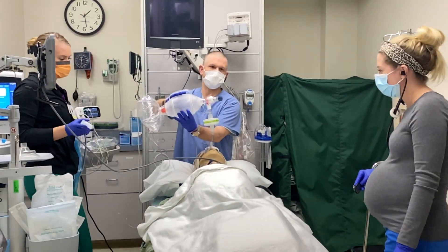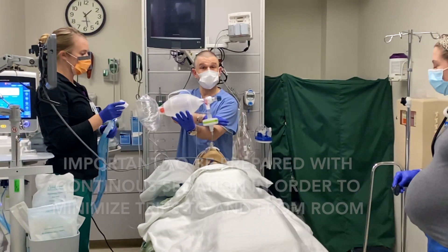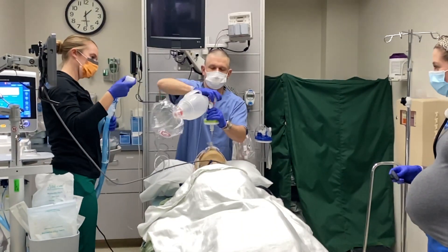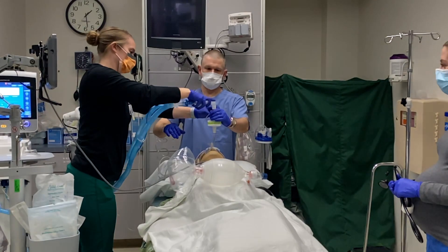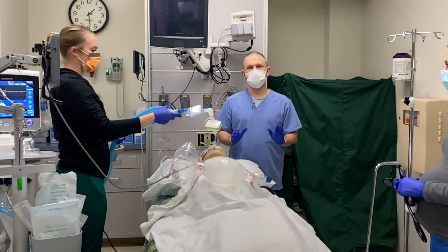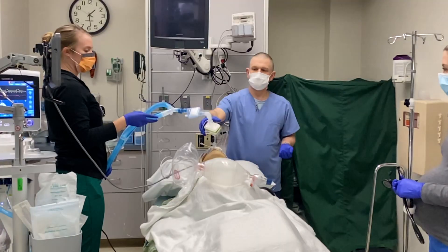Now we're going to make sure that the propofol, or the continuing sedation, is already in the room. The patient is still paralyzed with no spontaneous breathing. We're going to quickly transition the patient over to the ventilator. The respiratory therapist has the ventilator going — now we should be fine. There are no droplet problems because we have the patient on a ventilator with a viral filter.